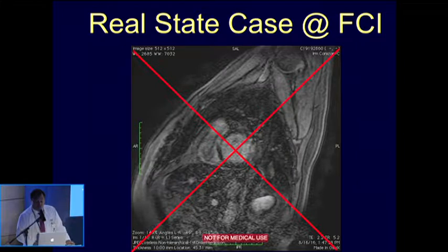So this is not the image quality that you should accept from your colleagues, be they radiologists or cardiologists. If you receive these images, or if you see that a report doesn't make sense, you need to talk with us first before you go to the EP lab, or else you will run into what Luis had to do. He had to cancel the procedure.